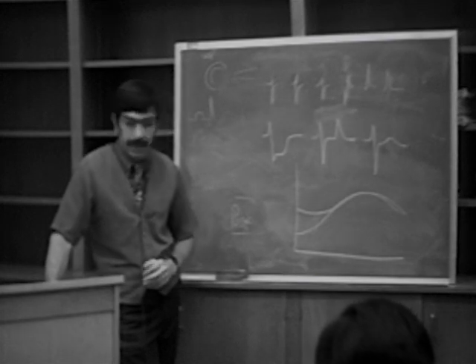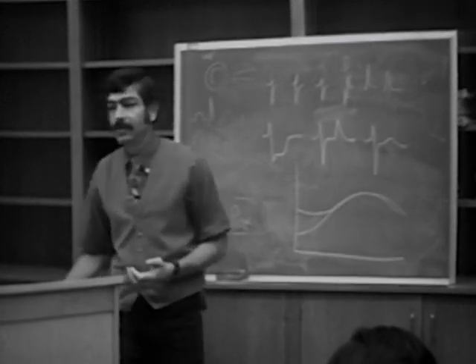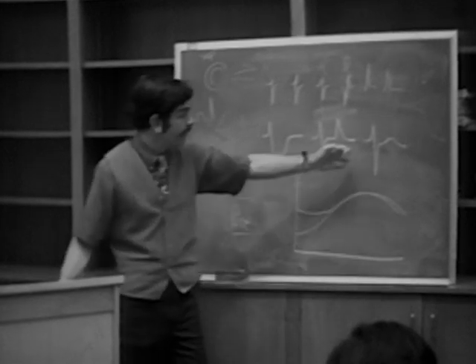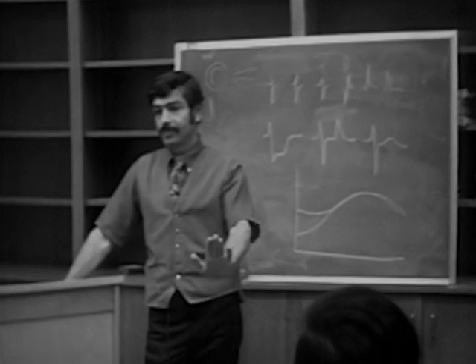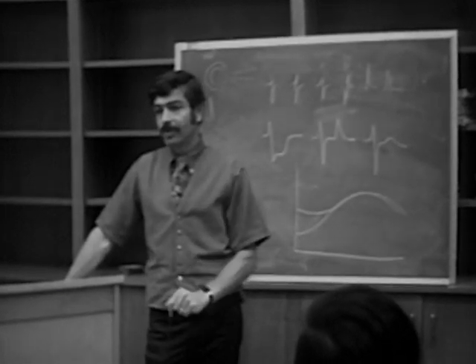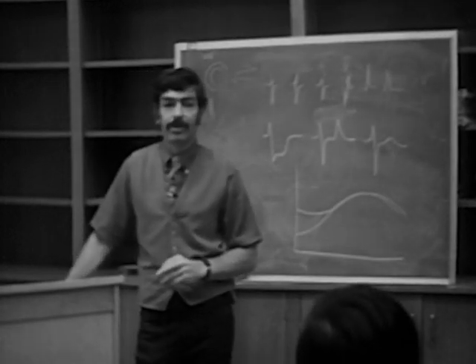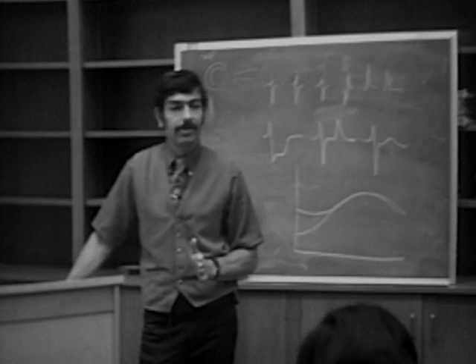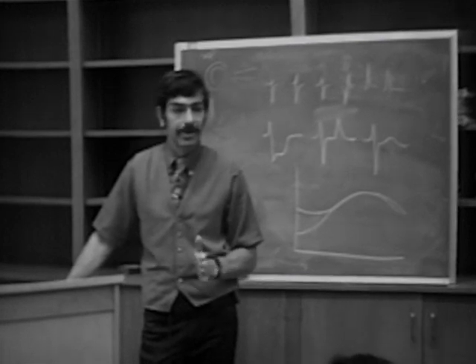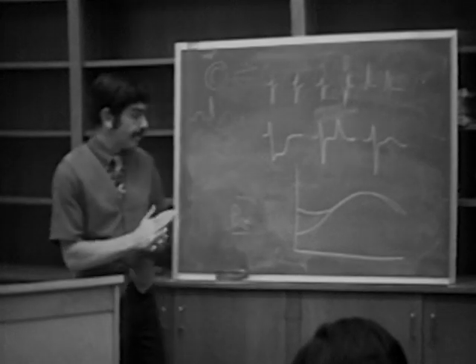diagnose it electrocardiographically. Certainly, it's easy to diagnose clinically, right? If you're trying to differentiate whether someone has right ventricular hypertrophy or direct posterior, all you have to do is put your hand on the patient's chest, right? If he has enough right ventricular hypertrophy to give you this kind of a change in the EKG, you'll feel a left parasternal lift, right? So it may be a problem to diagnose electrocardiographically, but certainly should be none clinically using other methods you have available.